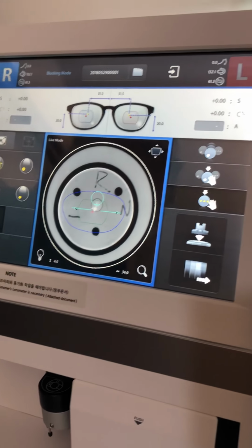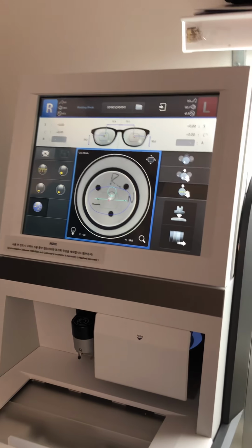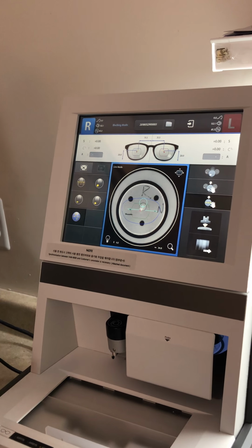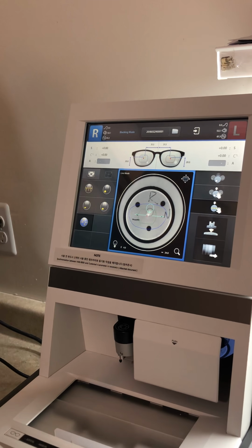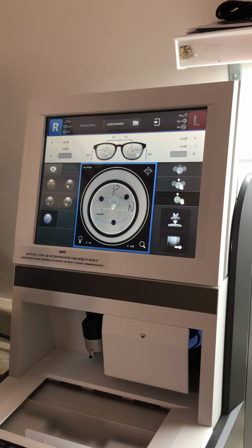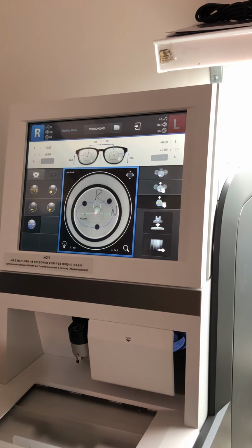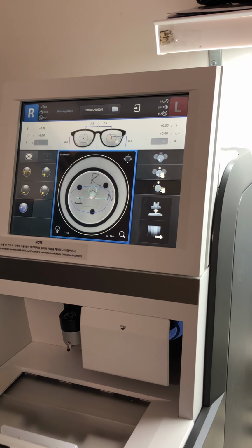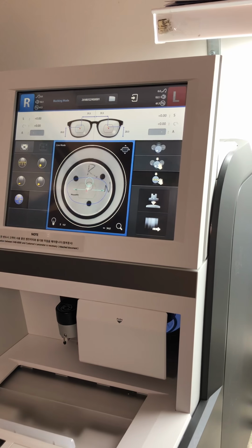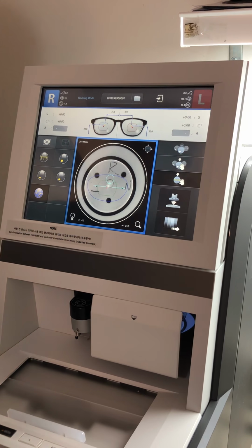Instead of just trying to, on your other blocker, you would just kind of try to make sure you had it in the center, within the area, right? Yeah, you're always in the area. We don't want to be in the area. We want to be as exact as possible. So this way we don't have any trouble anywhere else. You don't have any wide PDs or one PD kind of slips off to the right. This way, sometimes you don't know if your blocker is not blocking correctly, or the measurements you put in are not correct, or the lining up of the seg was incorrect. See, that's why I'm showing you all this stuff, so you get used to certain things and how it's supposed to be. So this one's a little bit narrower.